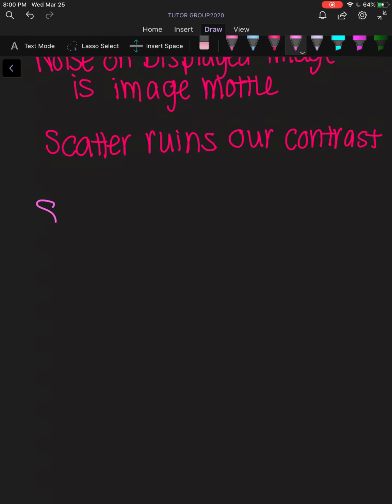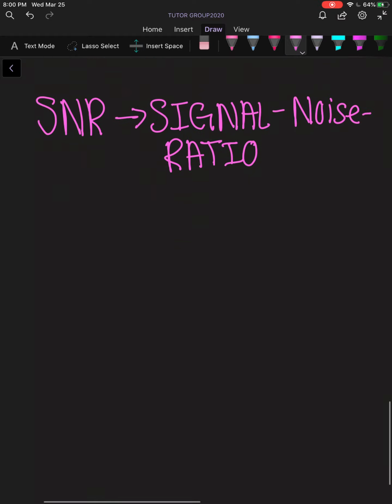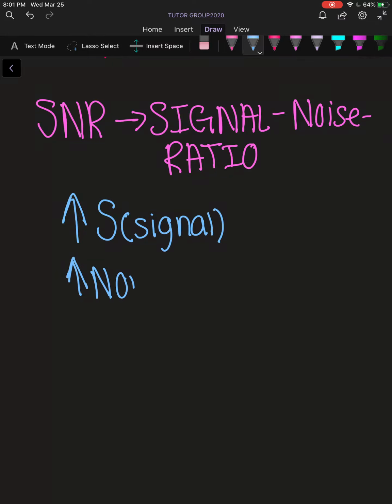Now, moving on to SNR, which is signal to noise ratio. I want you to know that you are going to want to increase S, which is our signal, without increasing your noise.